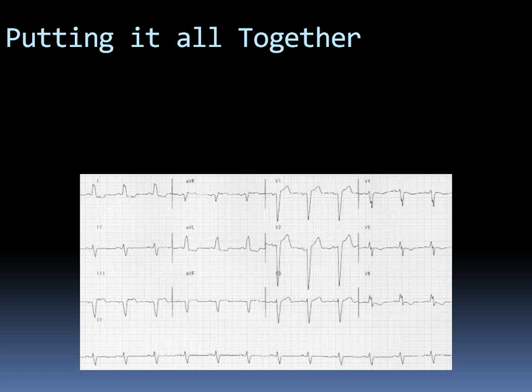We are going to emphasize today going over EKGs and applying the knowledge which we have gathered over the past couple of sessions, okay? At any time, if you don't understand anything, please feel free to interrupt me. I will be asking you some general questions and asking for your input on these EKGs, and I would appreciate it if you can participate, okay?